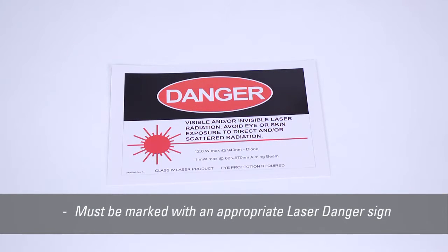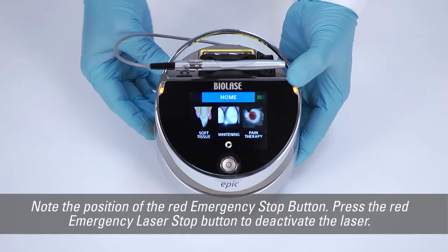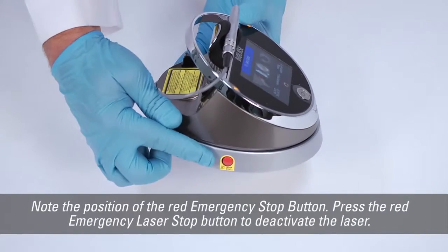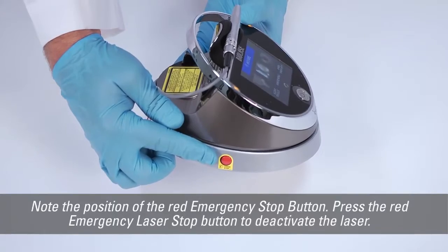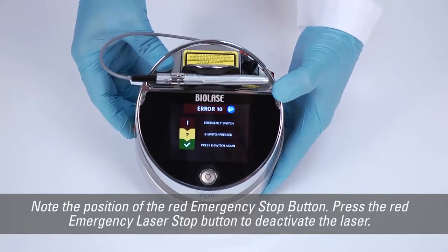Regulations state that any room where the EPIC laser is used must be marked with an appropriate laser danger sign, which is included in the top flap of your EPIC packaging. Finally, if for any reason you need to shut off EPIC because of an emergency, note the position of the red emergency stop button. Press the red emergency laser stop button to deactivate the laser.